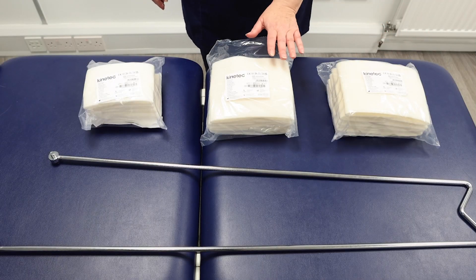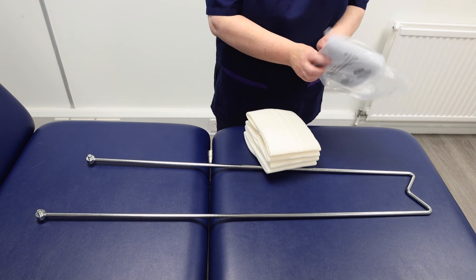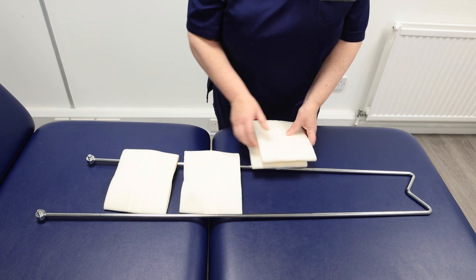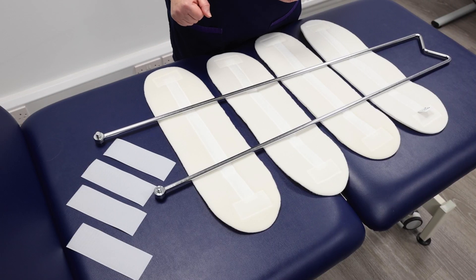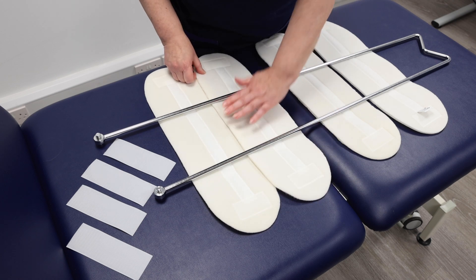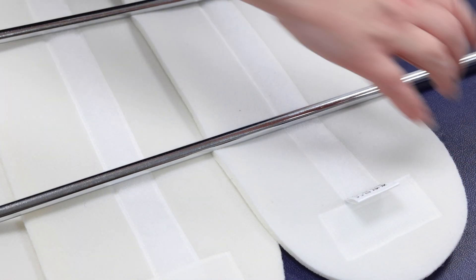Select the splint sling — these are available in large, medium and small. In this case we are using a medium size. Assemble the leg supports. Lay out the foam pads and hook-and-loop straps on a flat surface. Proper placement is crucial: avoid spaces between foam pads to prevent tissue herniation and pressure problems, and avoid excessive overlap which can create pressure points. A slight overlap is ideal.